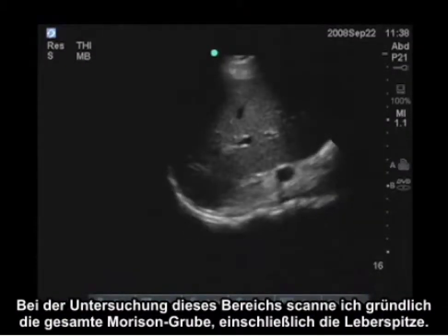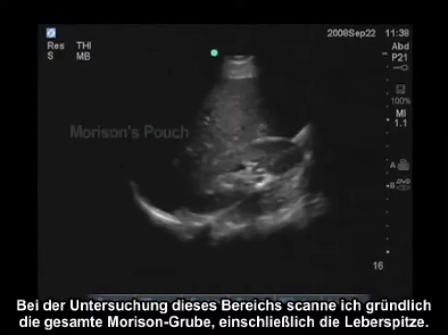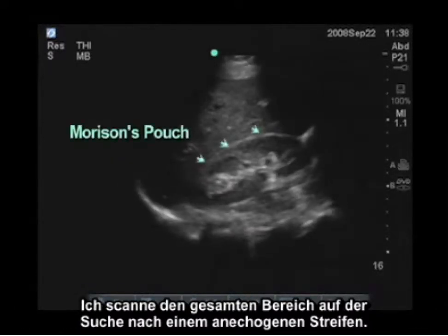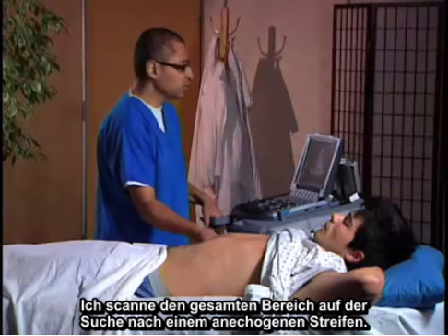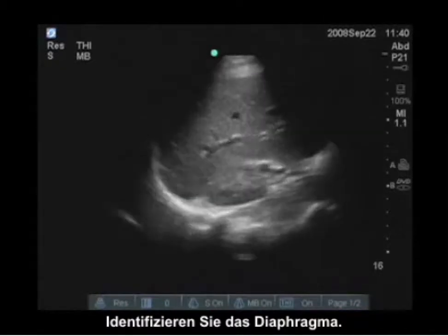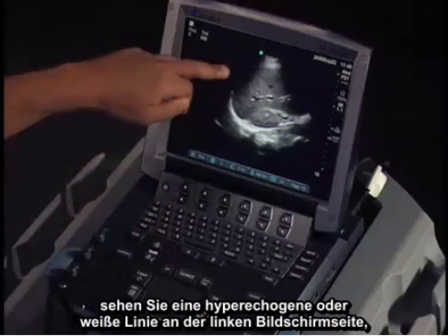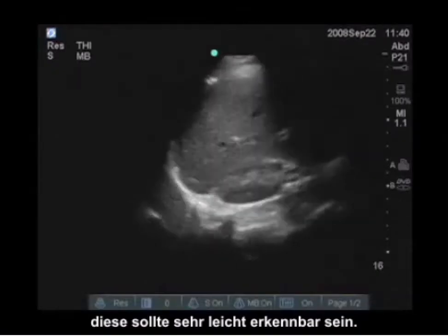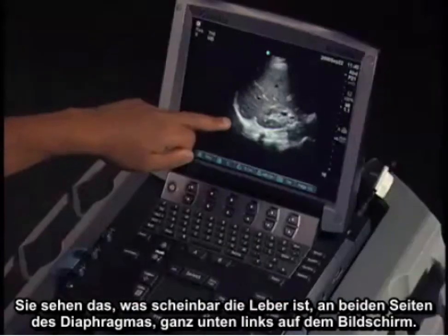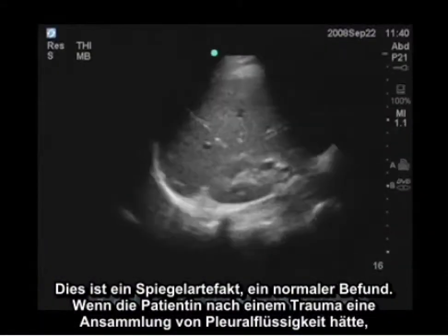When examining this area, I'm going to carefully scan through the entire area of Morrison's pouch, including at the liver tip, looking for an anechoic stripe. An anechoic stripe would be indicative of free fluid. I'm also identifying the diaphragm — the hyperechoic or white line to the left side of the screen. You can see what appears to be liver on both sides of the diaphragm; that is mirror artifact and is a normal finding.